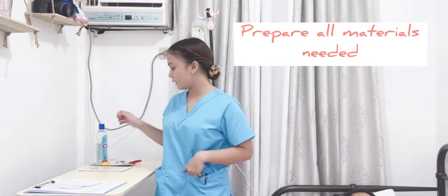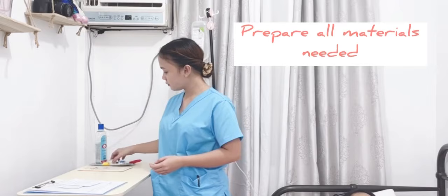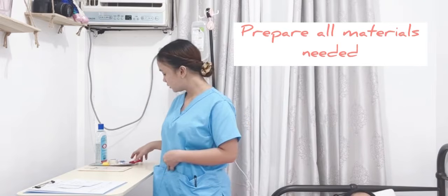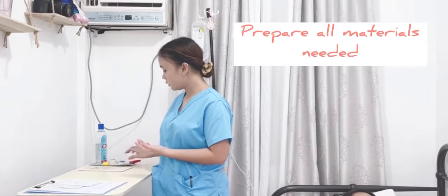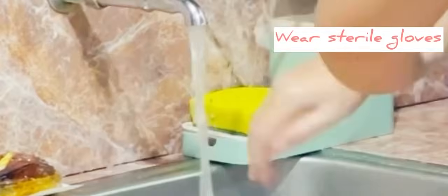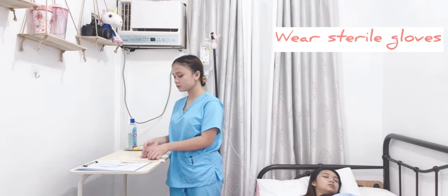I have here an alcohol, a micropore plaster, an alcohol swab, a band-aid scissor, and a sterile glove. Then wash hands to reduce transmission of microorganisms. Then after washing hands, wear sterile gloves.